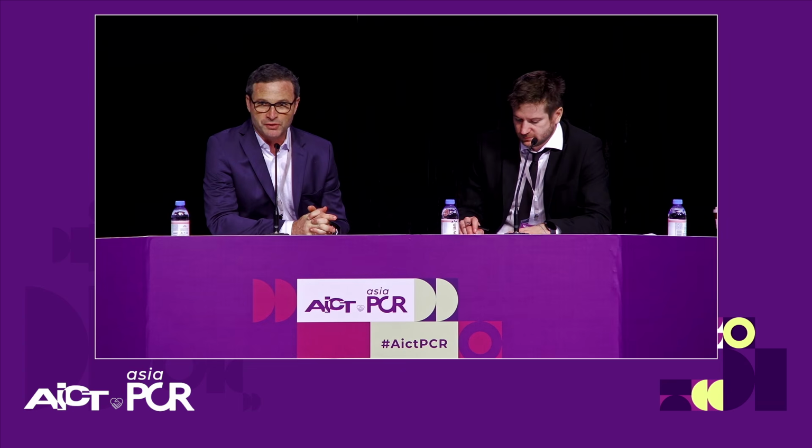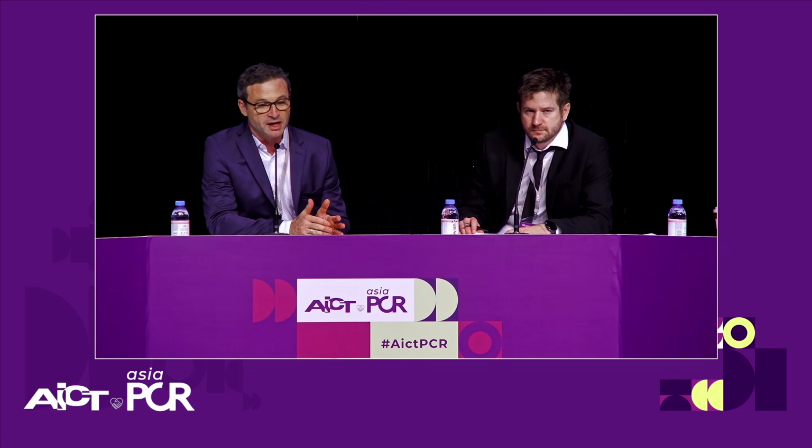It's a semi-compliant balloon, but it really doesn't matter because you only inflate the balloon up to 4 atmospheres. Then you start with the pulses, during the 10 seconds, 1 pulse per second. You keep the balloon inflated at 4 atmospheres only, and then after it finishes, for a few seconds, you take it to 6 atmospheres, and you go down. So the compliance of the balloon is not the main point. It's going to be equivalent to 50 atmospheres anyway. And actually, I believe that the main goal is anyhow the nice wall contact all over the balloon, and therefore a semi-compliant structure fits better to the concept.